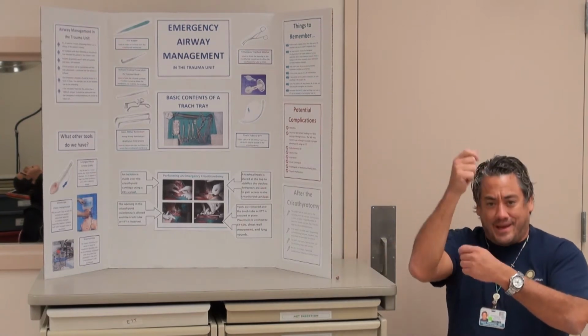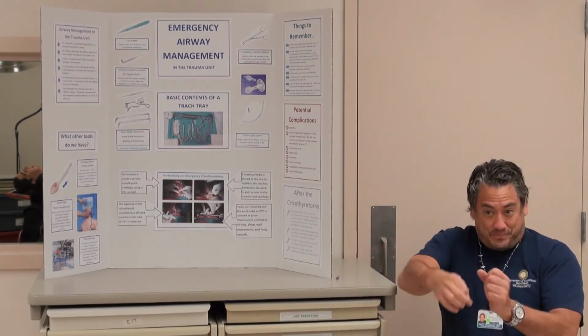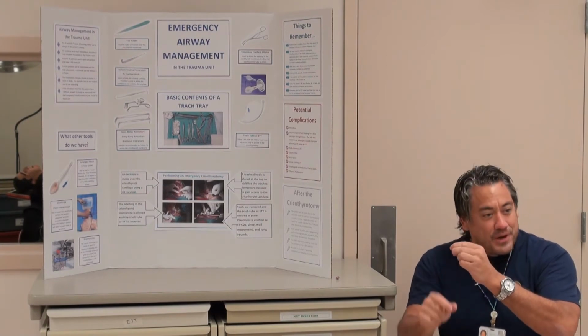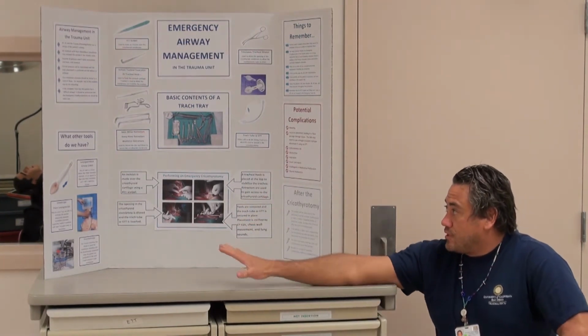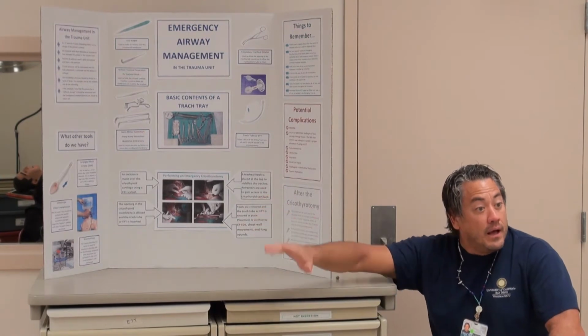And you've seen how they do that. They go down with the bronchoscope, they get that giant, well, sometimes they use a bougie, but usually it's the tube changer. They put that long thing in, take the bronch out, and then put the tube through. So those are the things we can use before we actually get the tray out.